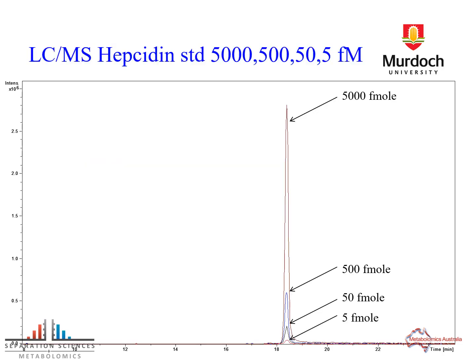We were able to show that we could detect hepcidin at low levels using our nominal mass instrument, and this particular series of concentration peaks represent MSMS measurements of the +4 charge state for hepcidin 25, where we do a full scan for the product ions, and this is for hepcidin standard in water.